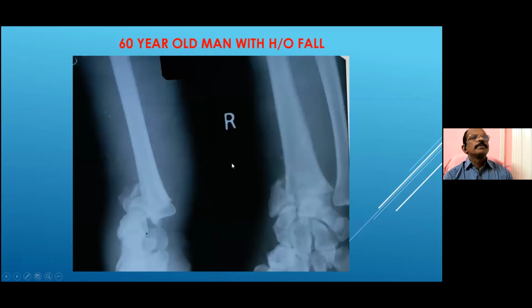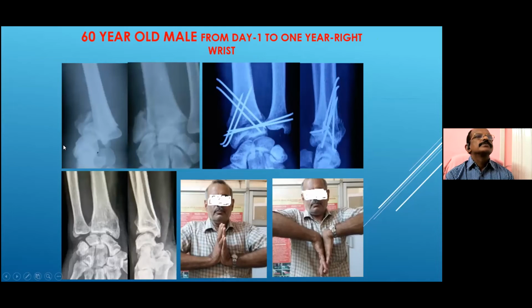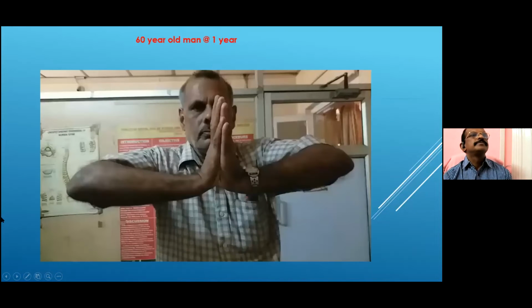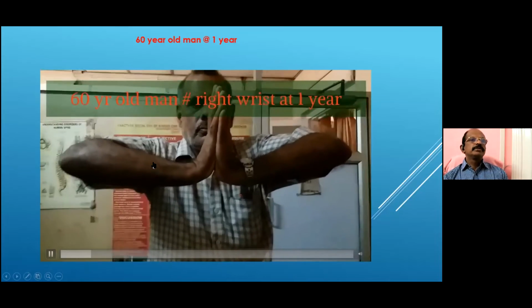This is a 60-year-old man with a severely comminuted fracture, distal end of radius, intra-articular. That's the fracture fixation. That is from day 1 to 1 year. You can see this X-ray. There is a slight stepping here, but it is less than 1 millimeter. You can see this range of motion of the same person.